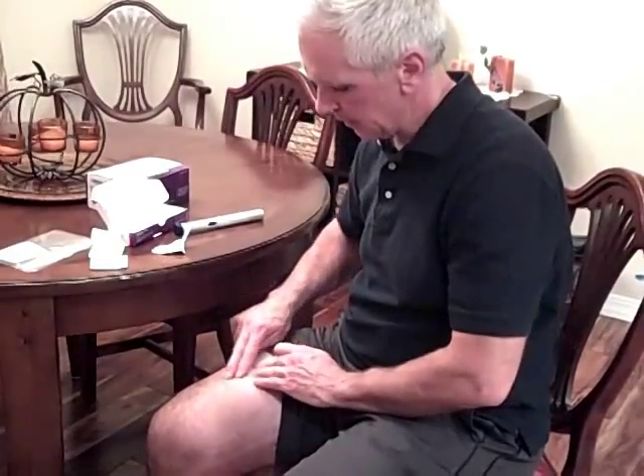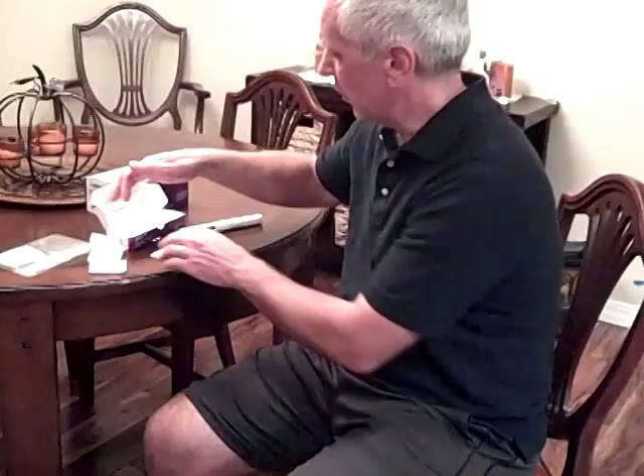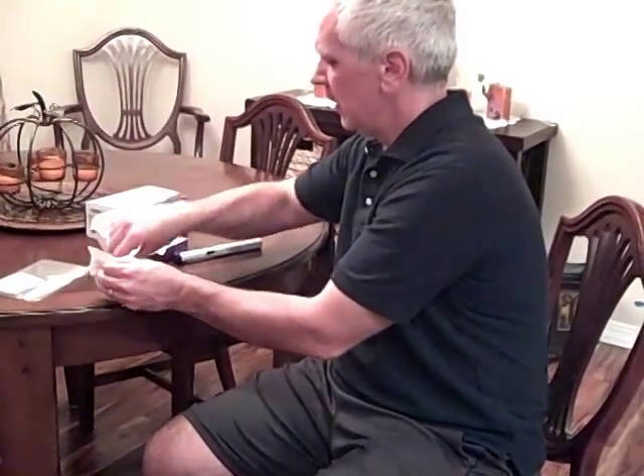Open up the band-aid and apply it like so, and we're all set to go. Most of this can just go in the trash, and of course the used pen needs to go in the sharps container.